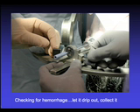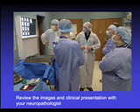It's important to ensure normal coagulation profiles before the surgery. If there's any bleeding at all, it usually will stop on its own. We gently irrigate the end of the cannula. We do not cauterize the cannula. We do not instill hydrogen peroxide or any substance through the cannula.